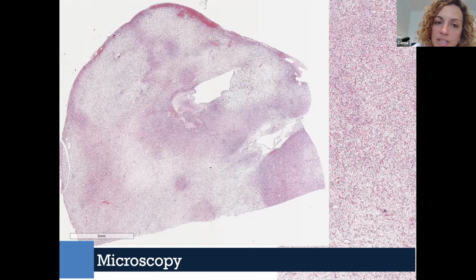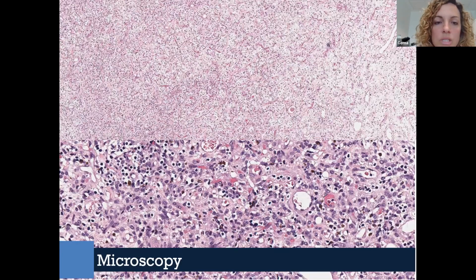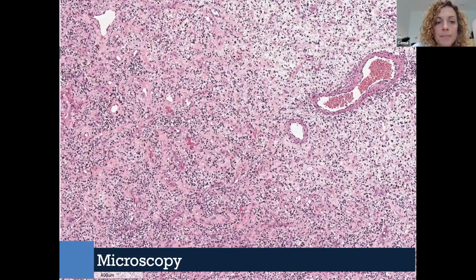More cellular areas were surrounding vessels and surrounding these empty spaces that you see here. Also, the vascular background was important. Sometimes it looks like a myxoid liposarcoma, but other times it was a more mature capillary network. In some areas, it was very difficult to recognize which were the neoplastic cells. There was an admixture with inflammatory cells, mainly chronic, so small lymphocytes, as you can see here on the screen, and plasma cells, and also pigment, hemosiderin. Here we see something like a pyogenic granuloma, with capillaries and this mixture of cells in between.